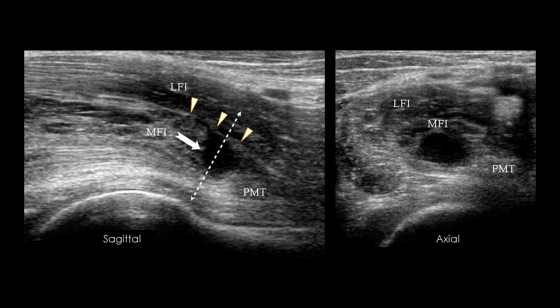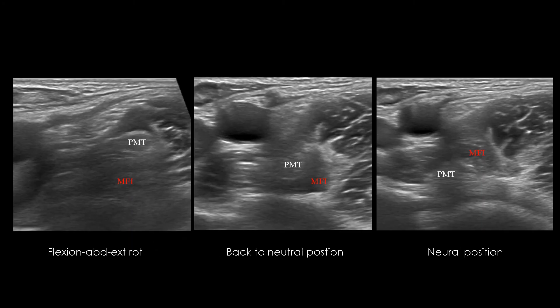Iliopsoas muscular tendinous injuries are usually seen in athletes due to trauma, particularly hip flexion injuries. These injuries involve the muscular tendinous junction of the medial fibers of the iliacus with the intramuscular fascia, indicated by orange arrowheads, which becomes the accessory tendon below. In this example, both sagittal and axial ultrasound views show a focal distal disinsertion of the myotendinous junction of MFI characterized by hematic collection, indicated by white arrow. With flexion abduction external rotation of the hip, the psoas main tendon rolls laterally and inferiorly over the medial fibers of the iliacus, trapping it between the tendon and the superior pubic ramus.